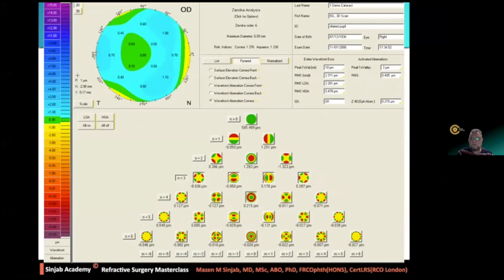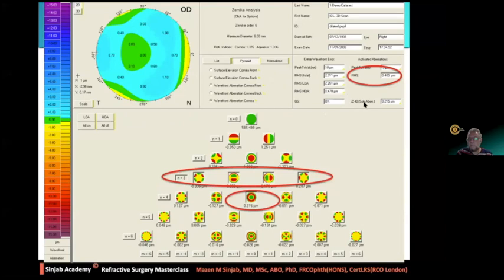And we have to look at this one, if you can see the mouse here, the Z40 or the spherical aberration, alone, because it has a meaning when we study both, the RMS in total and the spherical aberration alone.